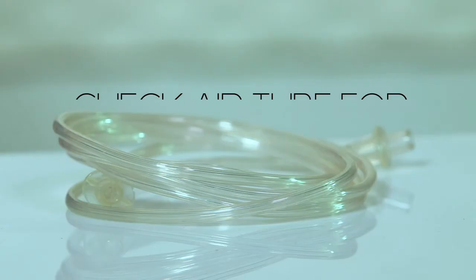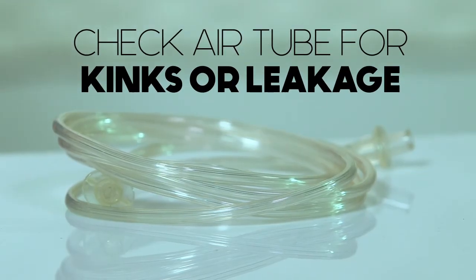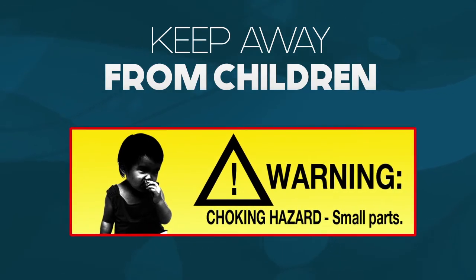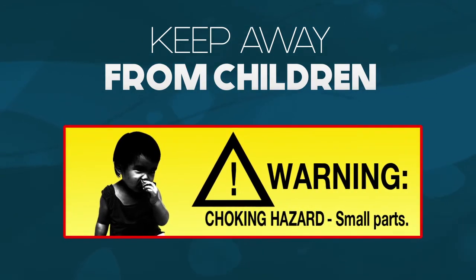Useful tips: please check the air tube for any severe kinks and confirm that there is no leakage from the tube. Keep the nebulizer and other accessories out of children's reach, as they have small parts that can be a choking hazard.